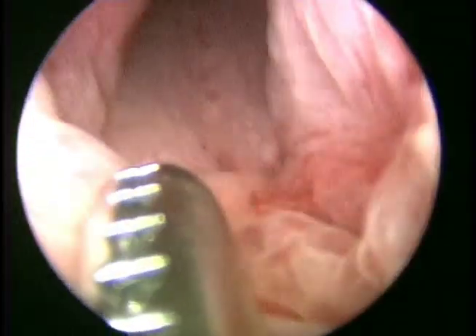Particularly for these larger pieces, we tend to remove the entire sheath along with the grasper and the tissue. This allows, number one, for us to pull out bigger pieces. It also keeps the bladder full and creating that hydrostatic pressure versus simply disconnecting the outflow and allowing the bladder to empty so that when we go back a second time, we don't have much water in the bladder. The blood percentage per fluid is much greater and therefore minimizes visualization. So for that reason, we take the entire sheath out for every removal of tissue pieces.